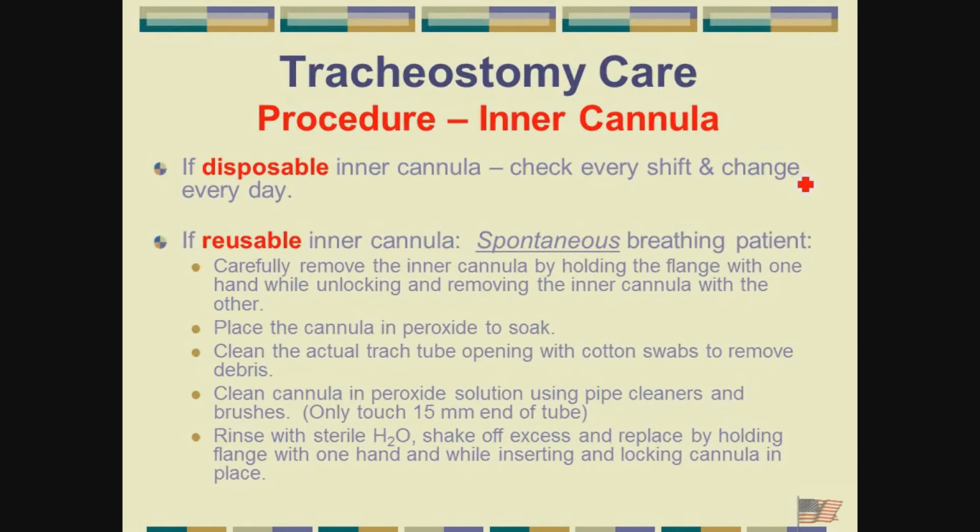So when it says prepare for a ventilator patient versus spontaneous, is that because of the reusable versus the? Well, it has to do with the fact that you have a whole lot more time to manipulate that and clean it and whatnot without having to worry about that outer cannula not having an inner cannula in. You can't do that with a ventilator patient. You can't ventilate the patient without that inner cannula in. So there actually is, to make matters worse, a temporary inner cannula you can use for mechanically ventilated patients while you're cleaning the other one. And that's why we're not going to concern ourselves with it during our PE.